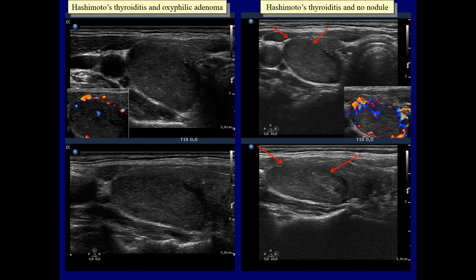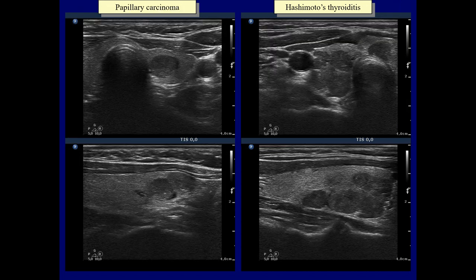However, this difference is not enough for an unequivocal sonographic differential diagnosis. There is only one relevant difference between the sonographic appearance of these cases. The papillary carcinoma contains two or three foci of microcalcification. Nevertheless, these cases have a striking similarity.